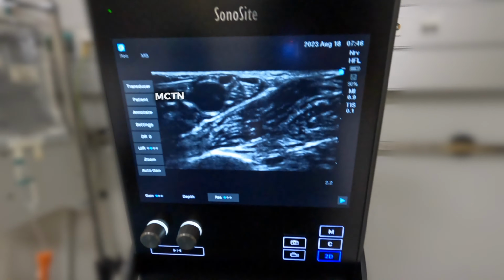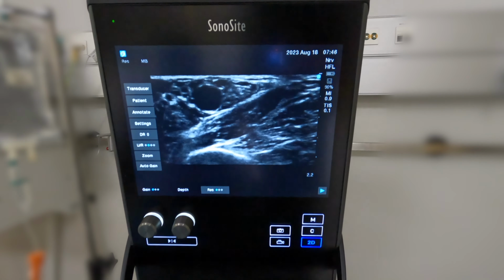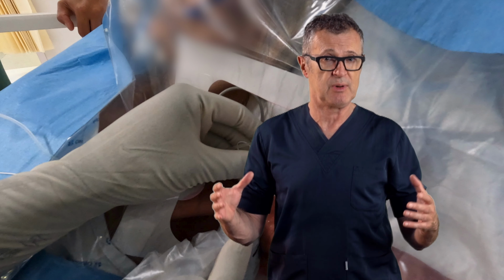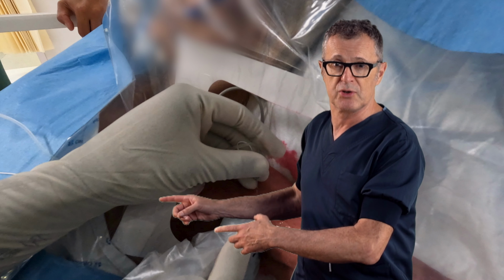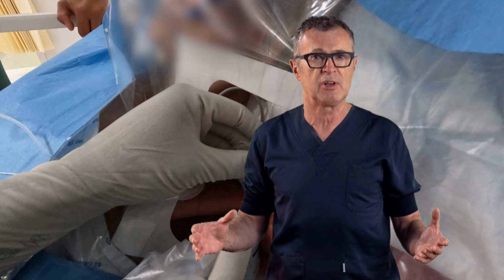The only thing we need to do is the musculocutaneous, so we don't want her to be able to flex her elbow during the operation. So let's look at the musculocutaneous nerve. You can see how carefully we had to advance and redirect the needle due to the lack of adipose tissue. And we injected only 10 milliliters of local anesthetic.